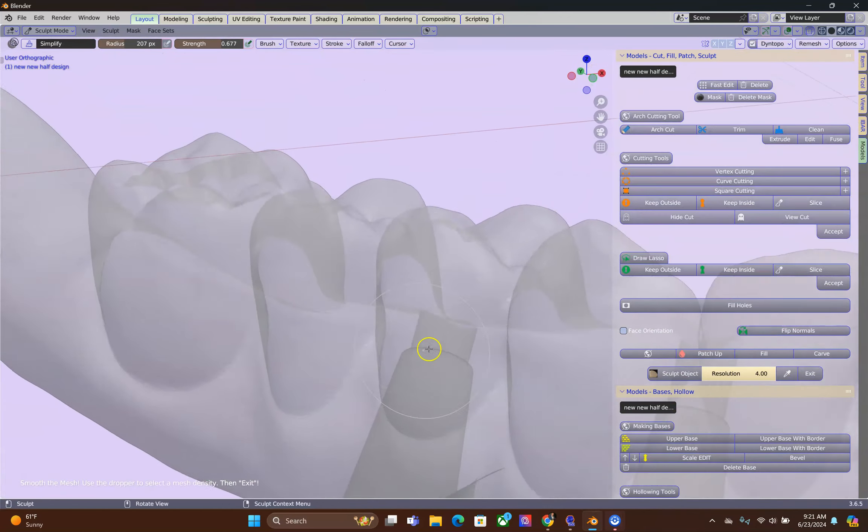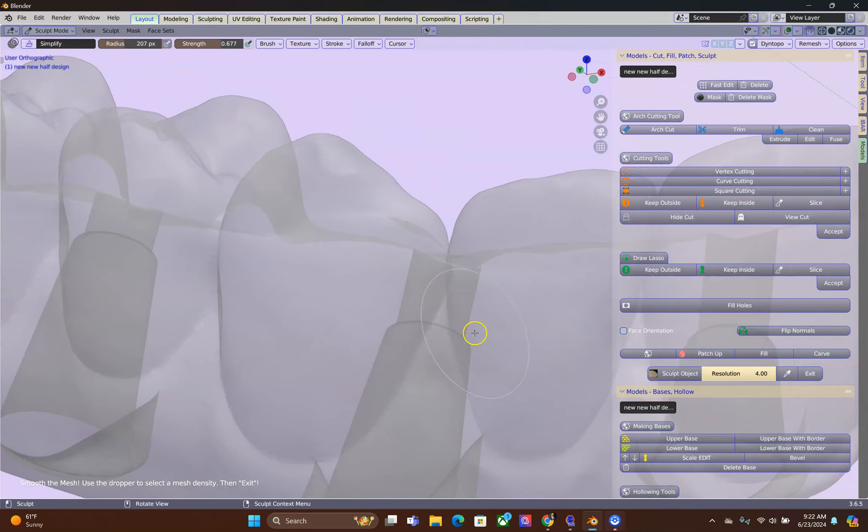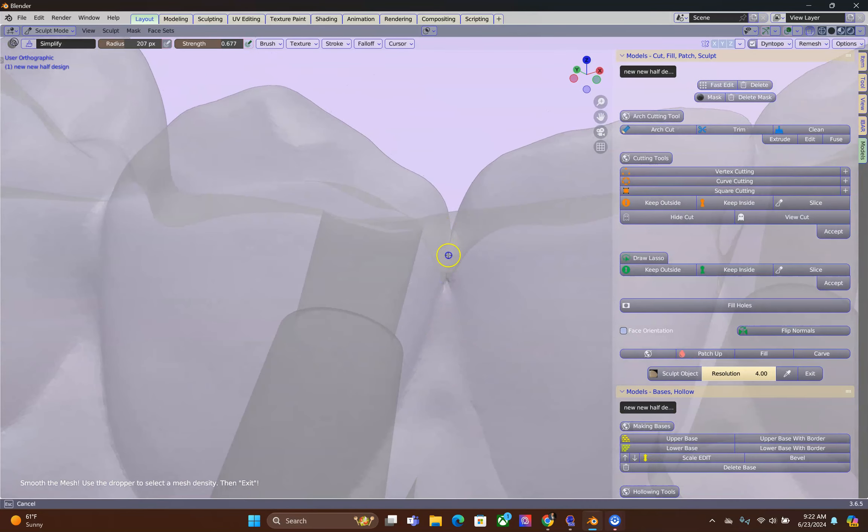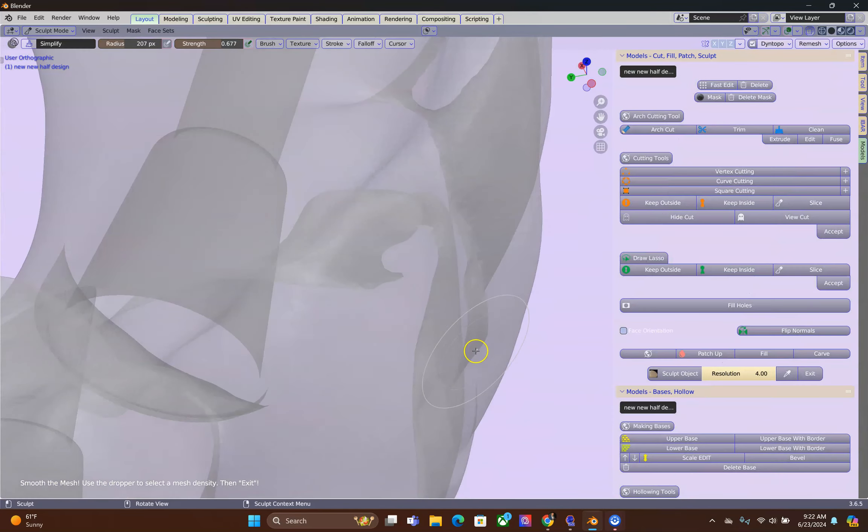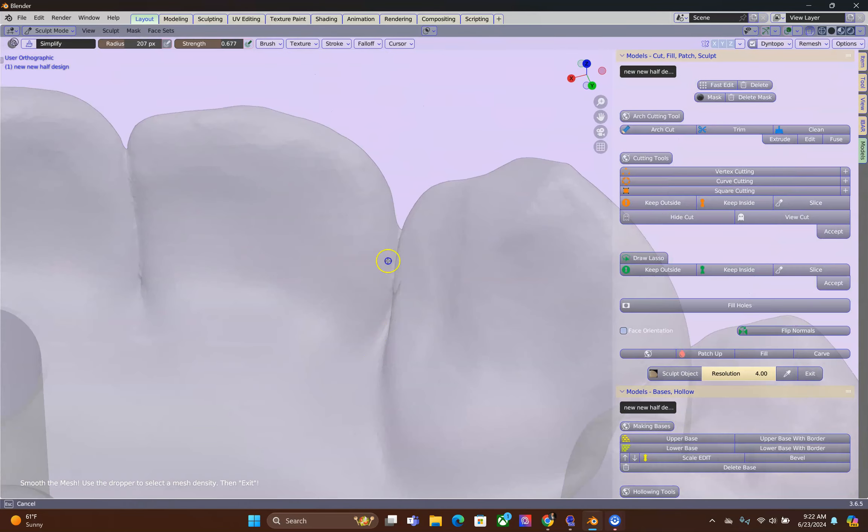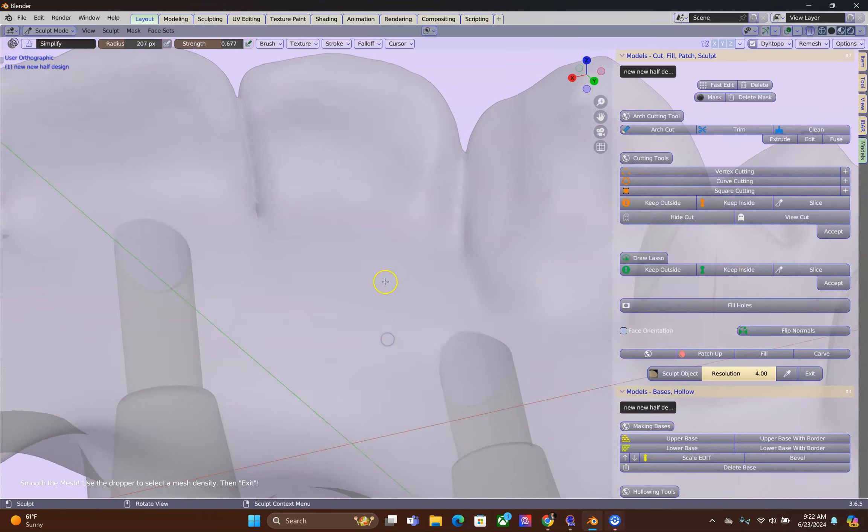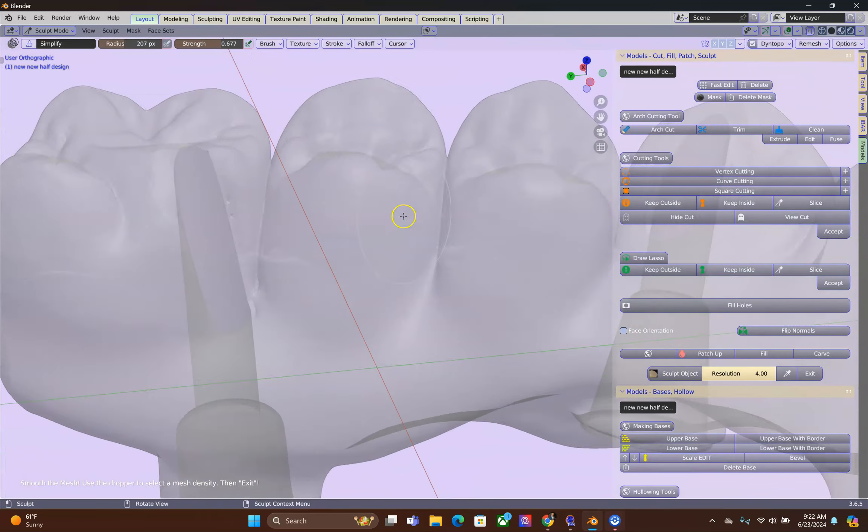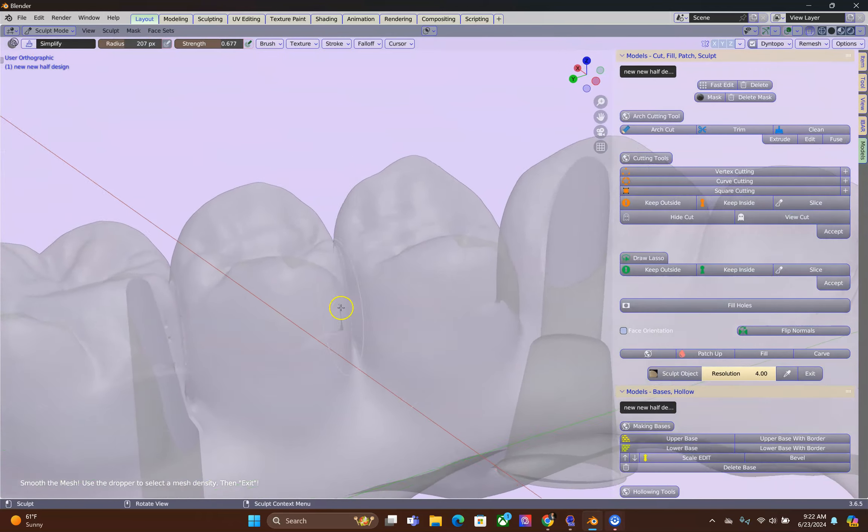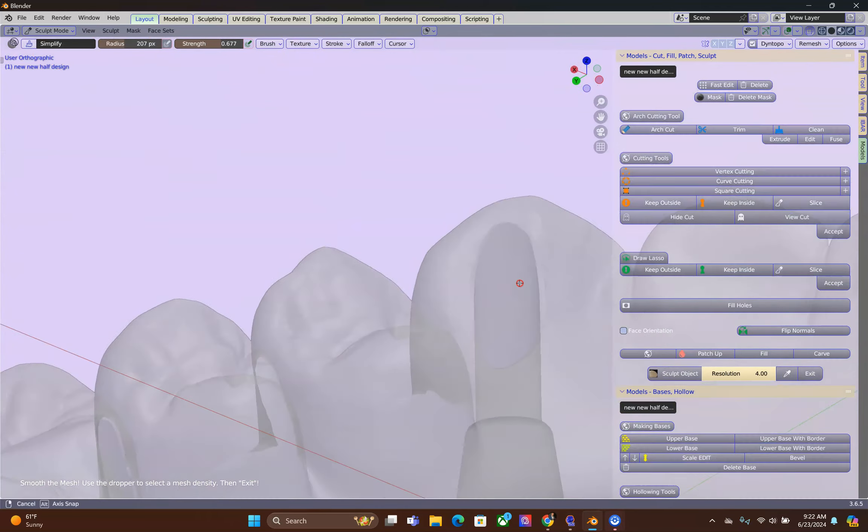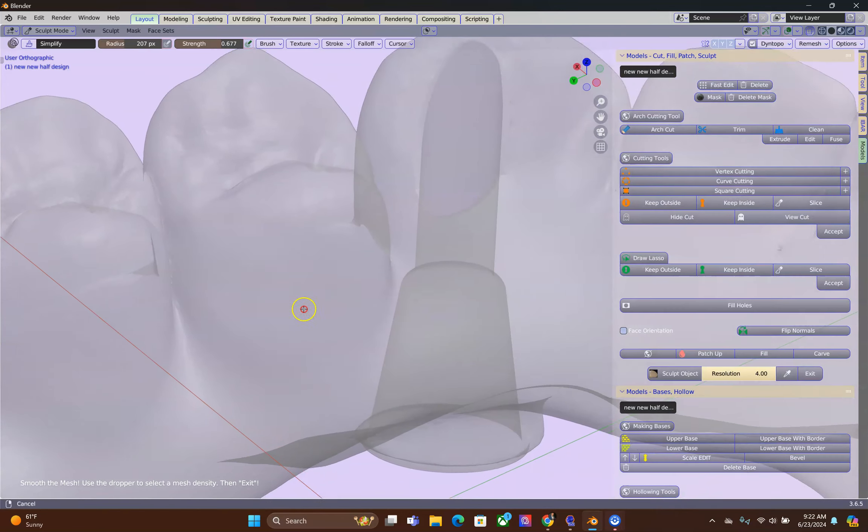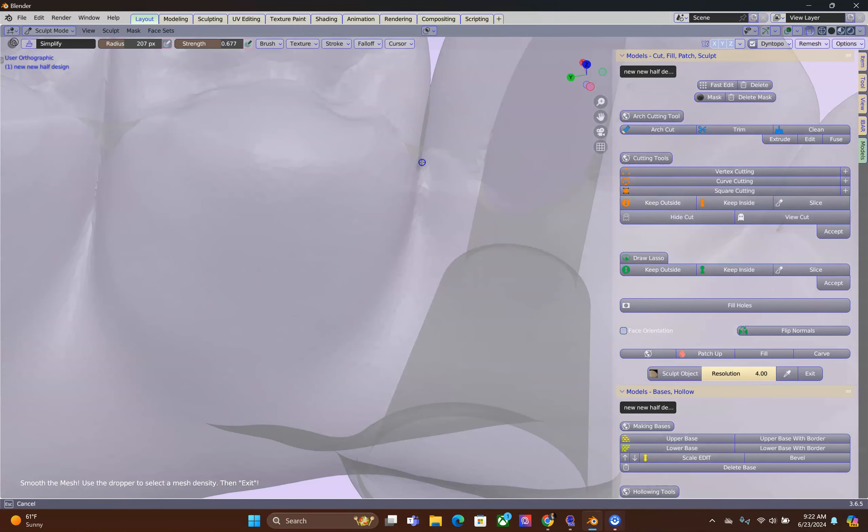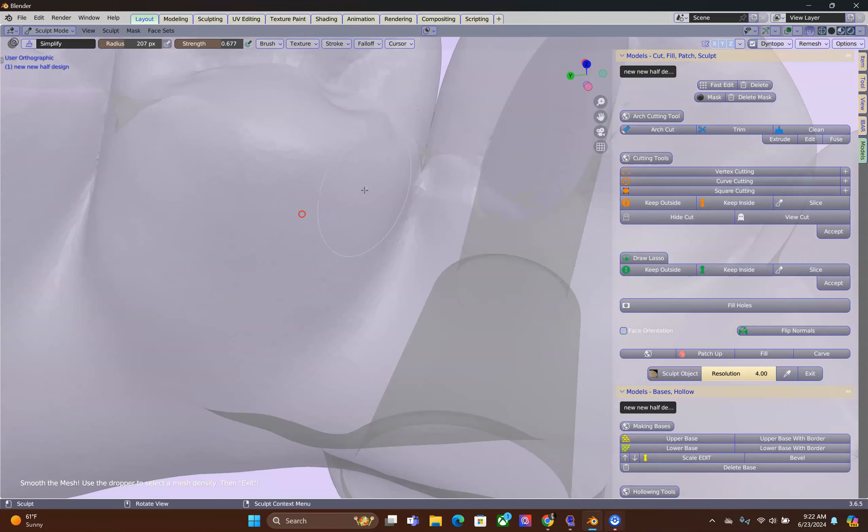So these two things are very important, checking for errors and then checking the contact interproximately areas to ensure that there's enough space for your bar. Alright, I'm going to fast forward and just smooth these contact areas a little bit.